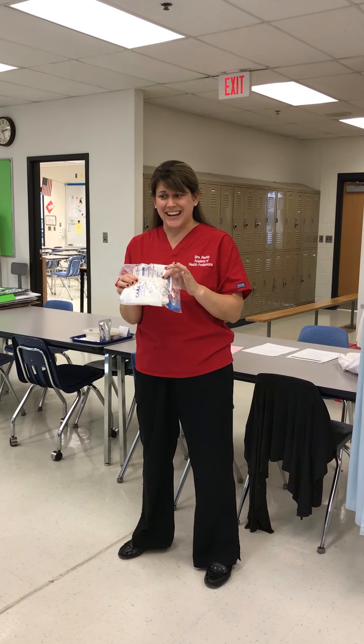You may or may not have that available to you. Worst case, you definitely need your tape measure, you definitely need your sizing guide, and then you can always go back and get whatever size that you need for your TEDs.